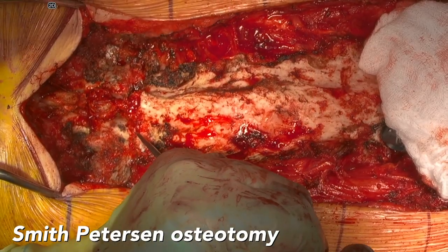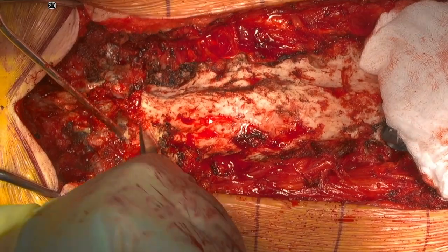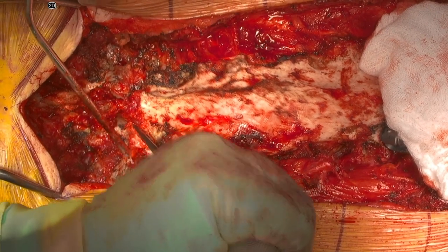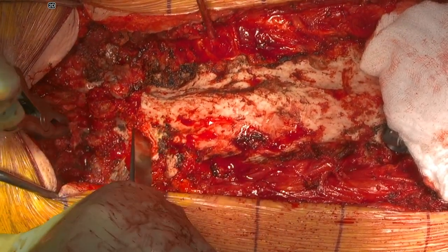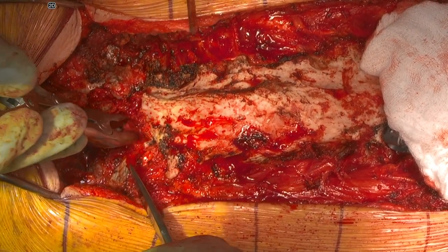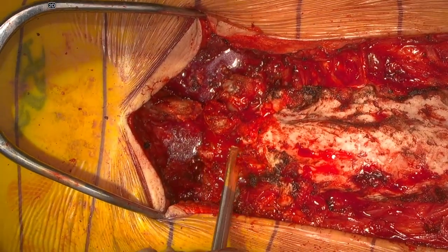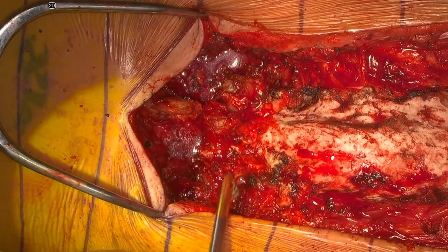The lumbar spine is then approached first. The Smith-Peterson osteotomy is performed by removing some of the fusion mass that is overgrown with an osteotome. This is done on both sides, and then the canal is encountered. A rongeur is used to remove the excess bone.